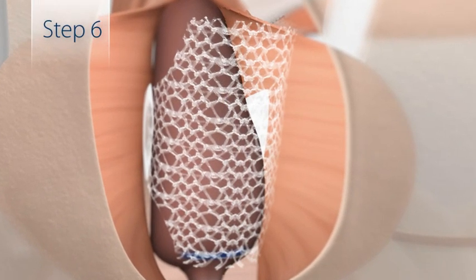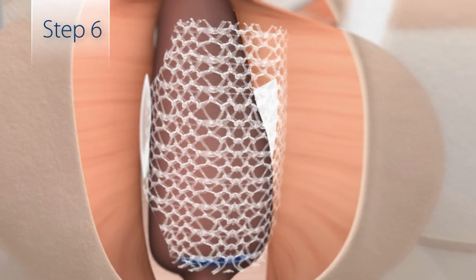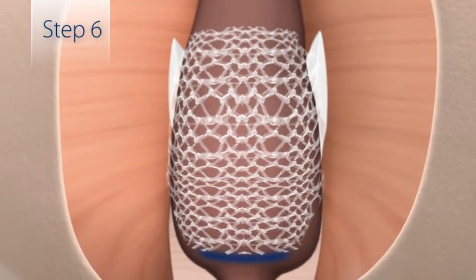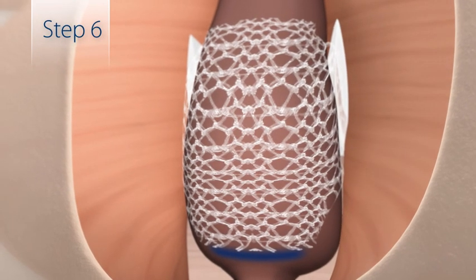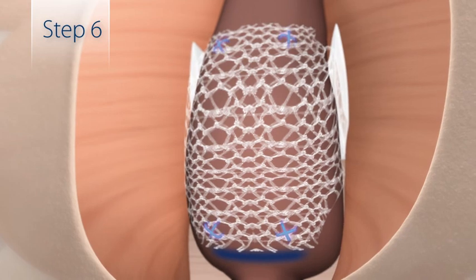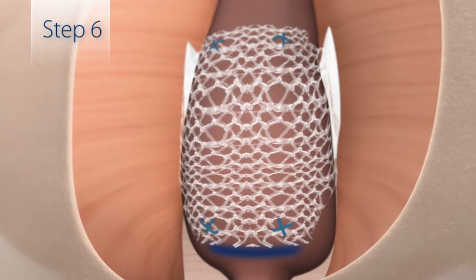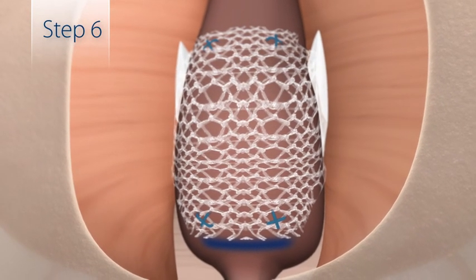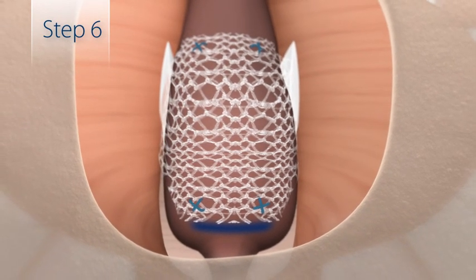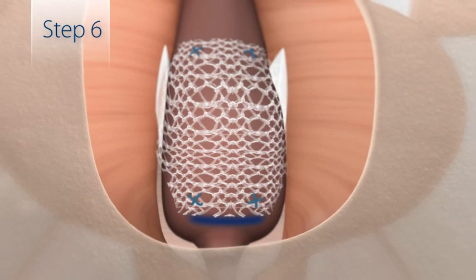Before suturing the sling to the bulb, position the center of the sling flat against the corpus spongiosum with the edge of the proximal flap at the previously marked point. Tack the center portion of the sling to the corpus spongiosum proximally and distally using resorbable suture. The suture should pass through the mesh at least 2 pores from the edge of the sling to ensure sufficient fixation.